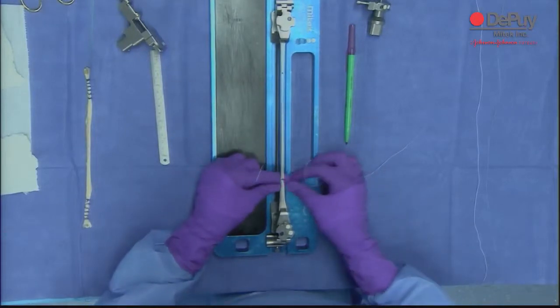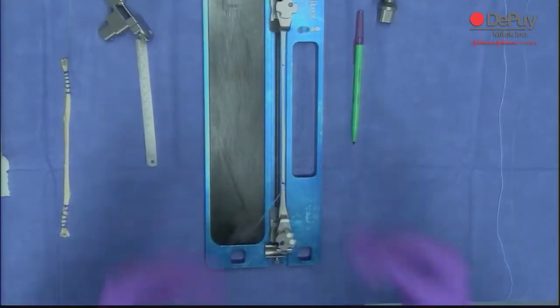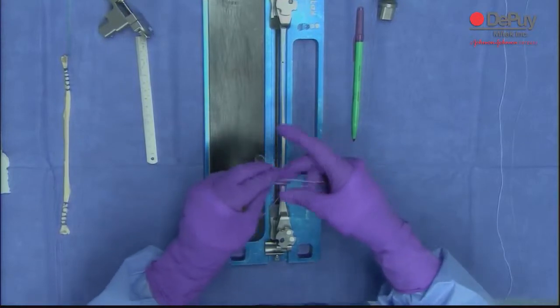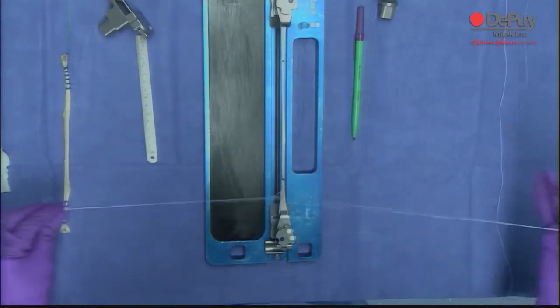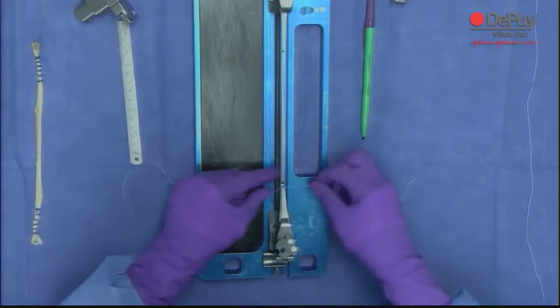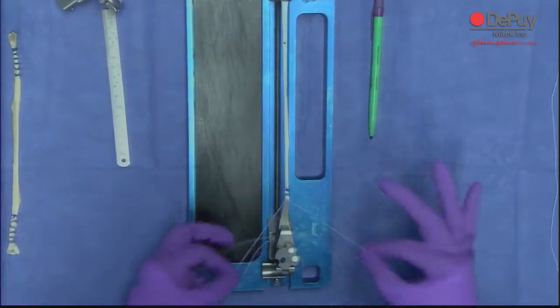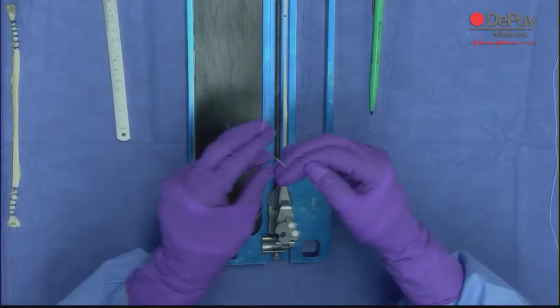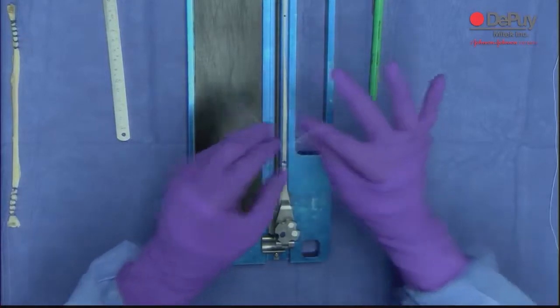Now I bring it underneath, come on top, throw a half hitch. I'm doing half hitches so you guys watching this can understand it, not the way I normally suture. Underneath, half hitches.